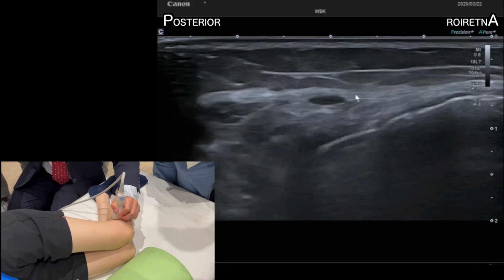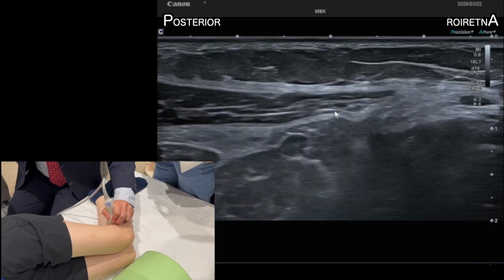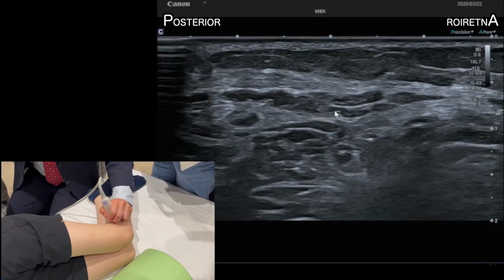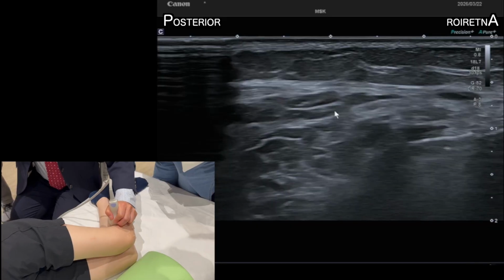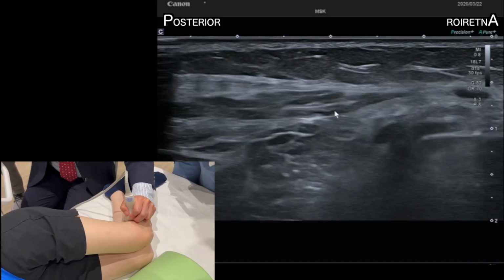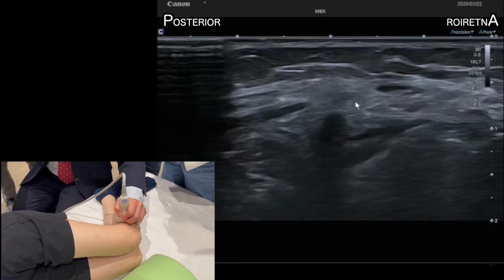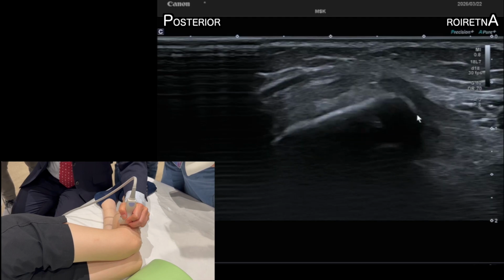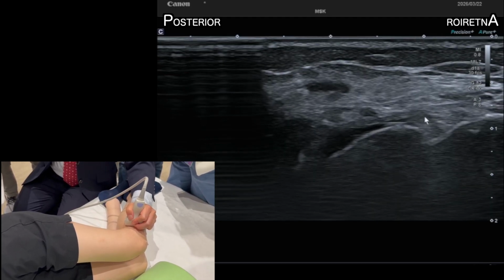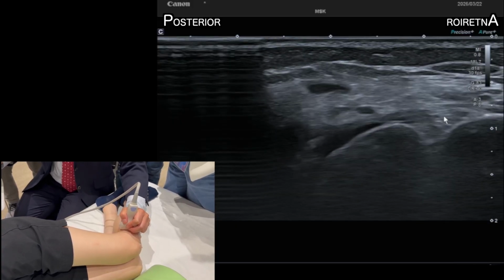So we are in short axis to the biceps femoris tendon proper here. But then because the orientation changes as this sends the fiber toward the tibia, it suddenly becomes in-plane long axis view here. So this is the tibial arm of the biceps femoris.